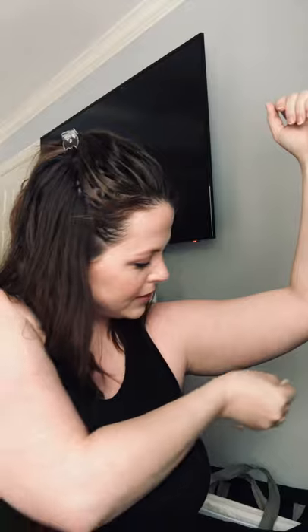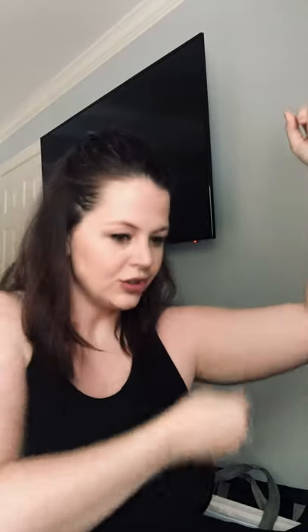So you start out with an alcohol wipe and you're going to wipe in the fatty part underneath your arm. Let's get a good section going and cleanse yourself.